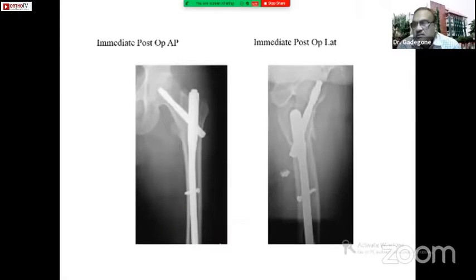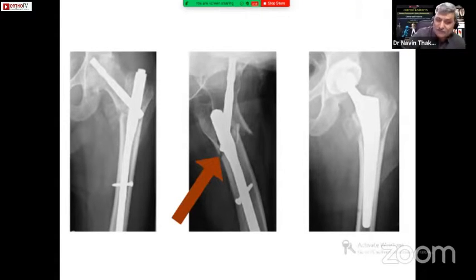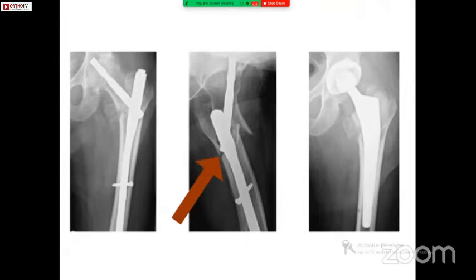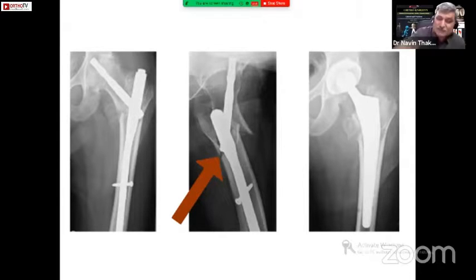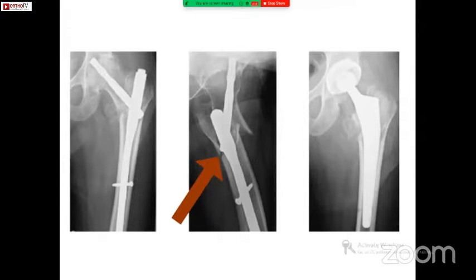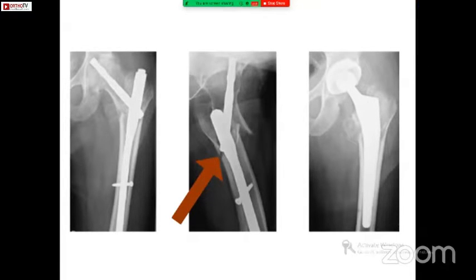Navin bhai, sorry. Yes, tell me. This is not a dynamic implant. This is a static implant. No, sir. It is dynamic. It is a collapsible implant. No, but once your screw is inside the bone. It is collapsible in that 130 degrees, sir. But the outer border of the screw has gone inside the bone. It is not outside the bone. Because of the toggling, sir.